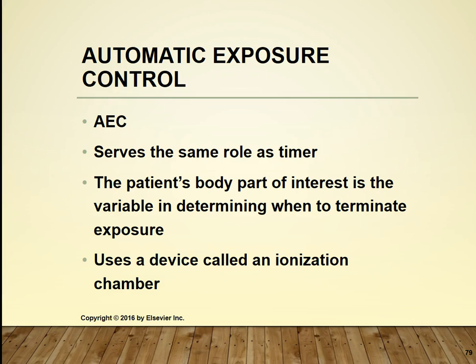AEC calibration is performed by installation personnel. That means whoever put in that piece of equipment. They use phantoms, usually out of acrylic or something like that, and they determine with the different types of thickness on those phantoms what it needs to be set at. So that's not something that you would do, but you may sometime be asked, how is AEC calibrated? And that's upon installation, and then your QC, as it moves forward, will check that every so often.